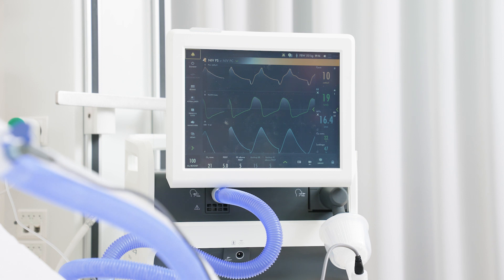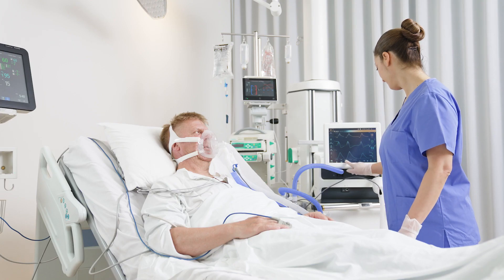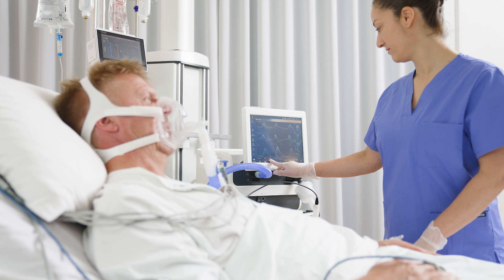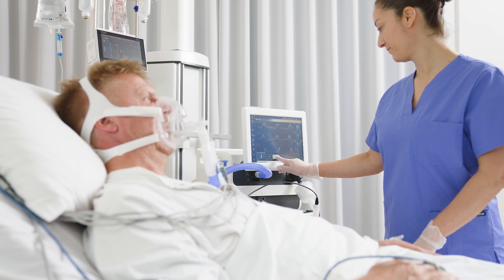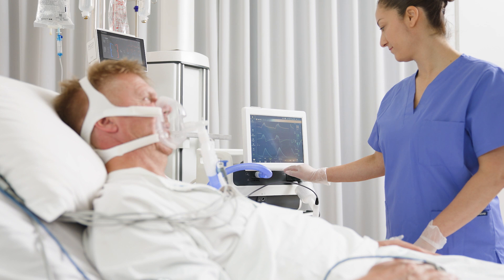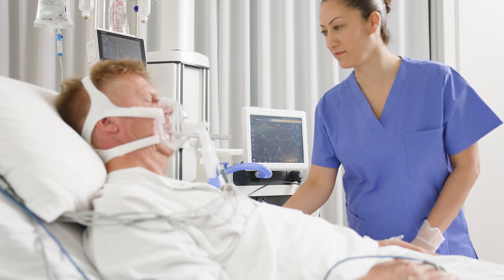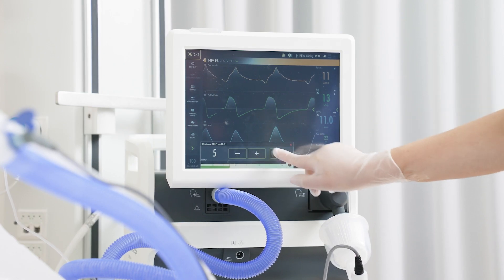The pressure supported breaths are triggered by the patient. The patient controls the respiratory rate and the ventilator delivers support using the preset pressure support above PEEP, or the delta pressure.